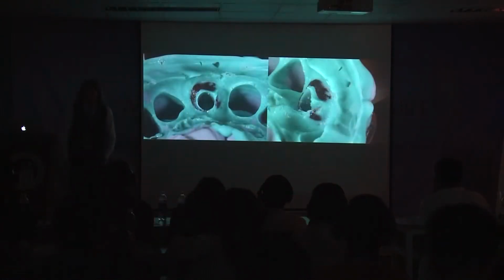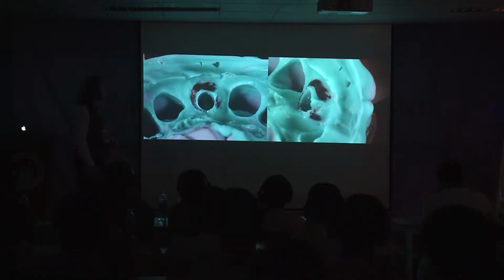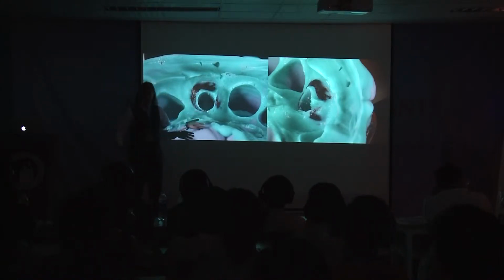The better, of course, is bone regeneration. But this can be a good compromise. This is one of the different techniques that can be used to replicate the emergence profile.